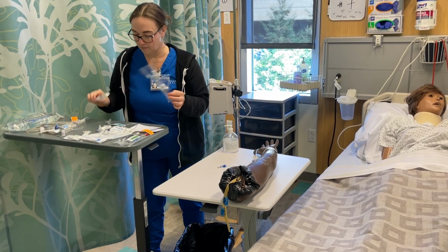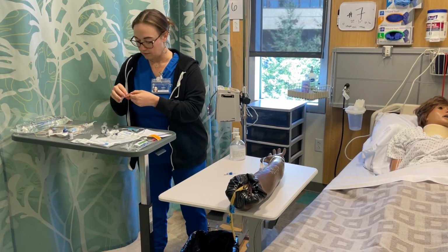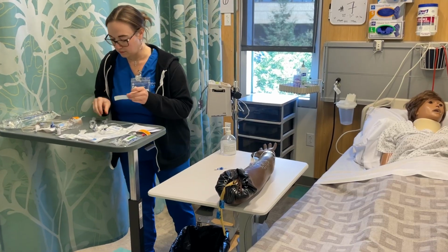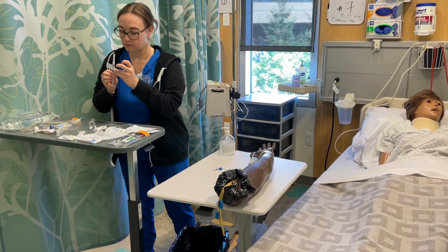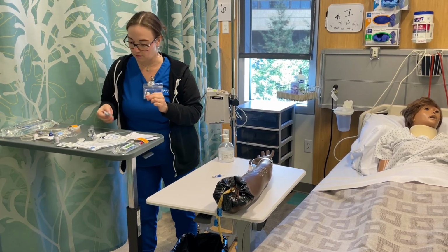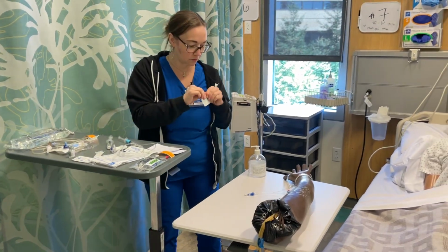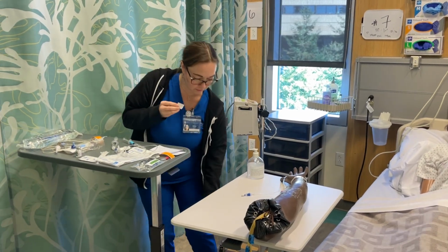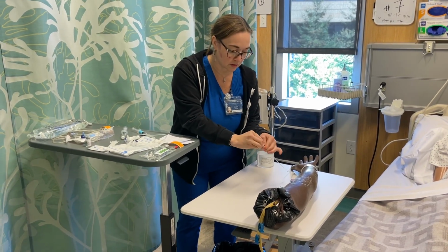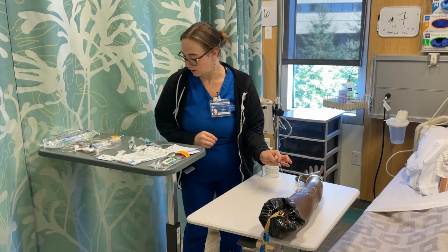And before I do that, this medication here is also labeled with her name and then the date, right dose on there. Okay, and I'll get an alcohol swab. I'm going to clean this off here for 30 seconds. Make sure to get the sides as well. Really clean that off there. And then I would let that dry.